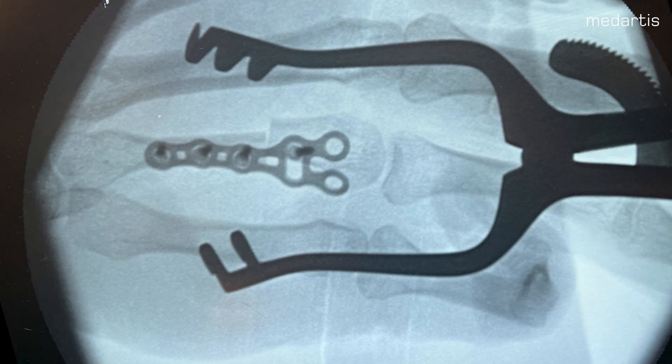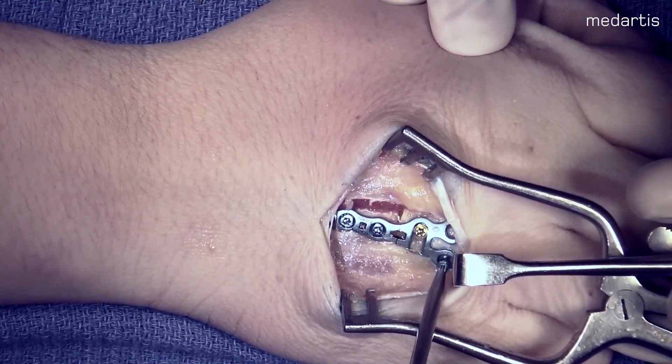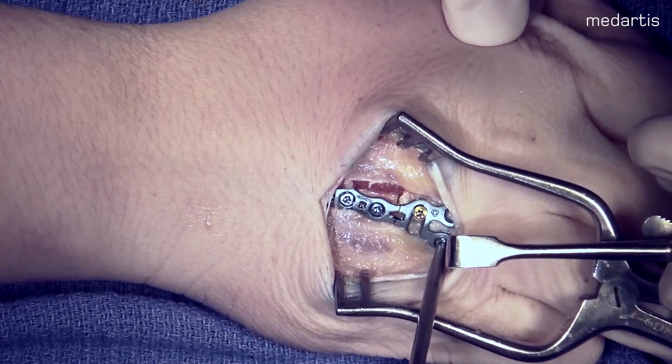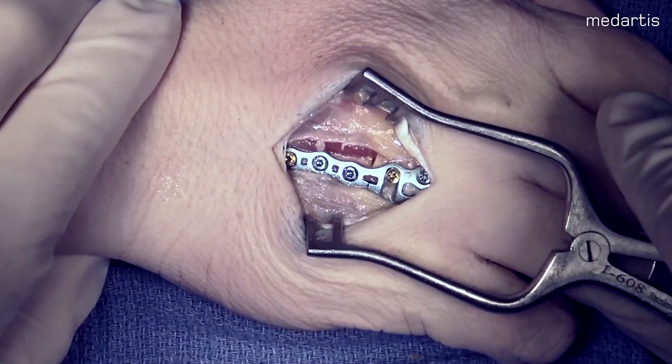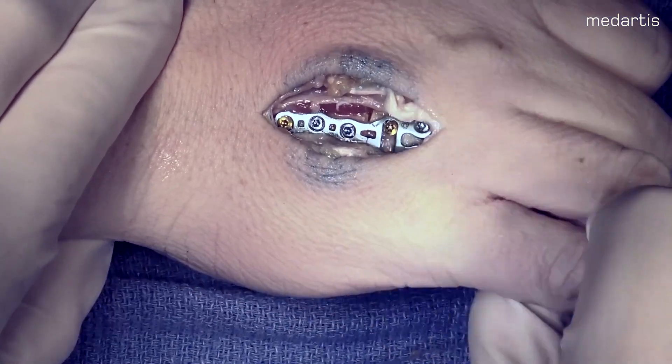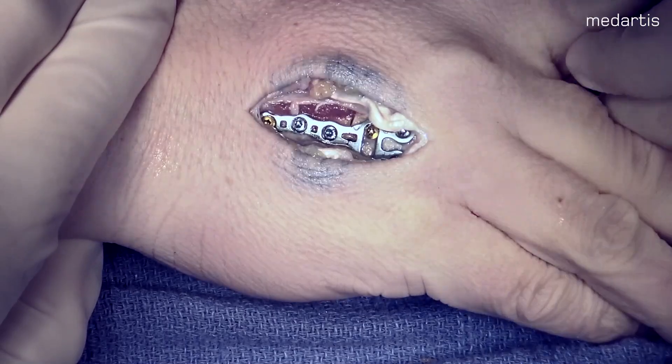You can see with our imaging there is excellent rotational correction, with just a small amount of overlap on the radial distal border. Here you can see we are going for maximum correction. After achieving the appropriate correction, you can now tighten down the screws to maintain the rotation. Clinically, you can see how 15 degrees of rotation built into the oblong hole can change the anatomic position.